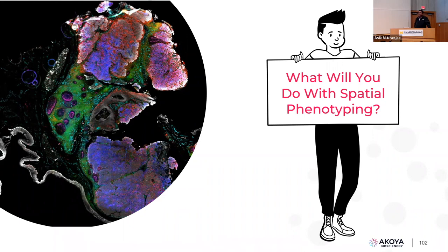A 20 antibody panel would be 5 hours based on the tissue size, because it includes both the fluidics and the imaging time.